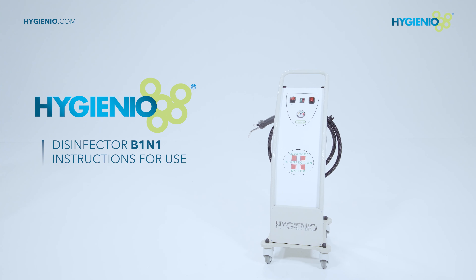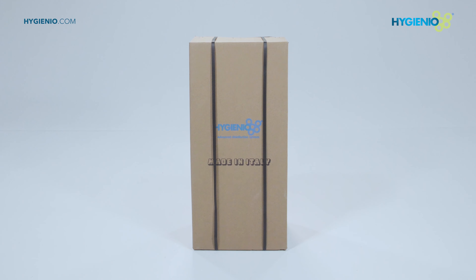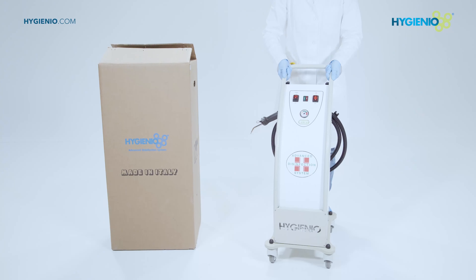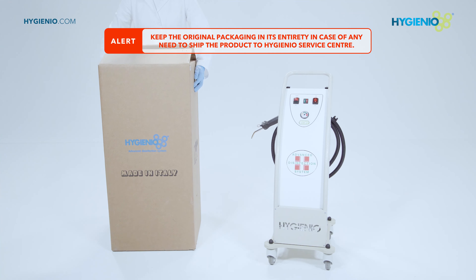Disinfector B1N1 instructions for use. Open the box from the top. Remove the internal protections and lift the disinfector upwards to remove it from the packaging.